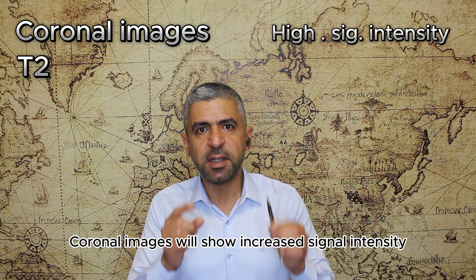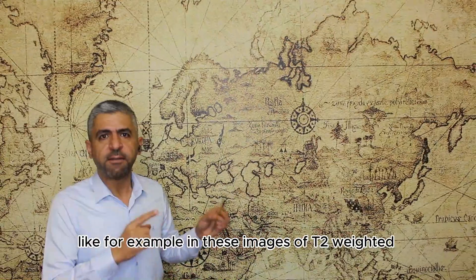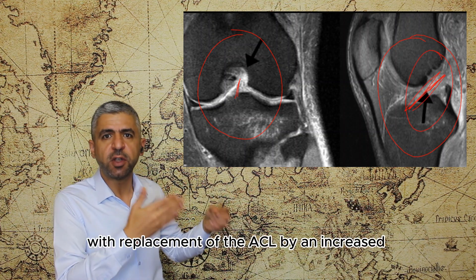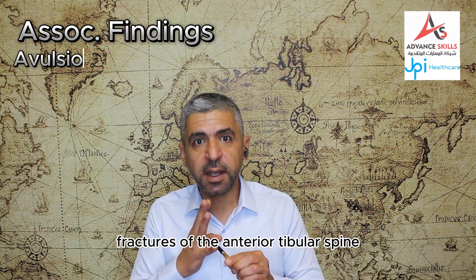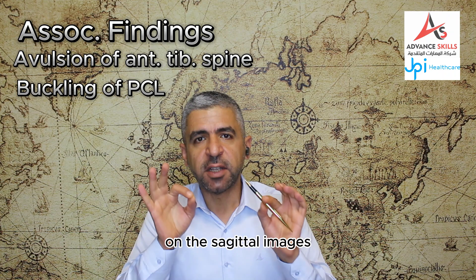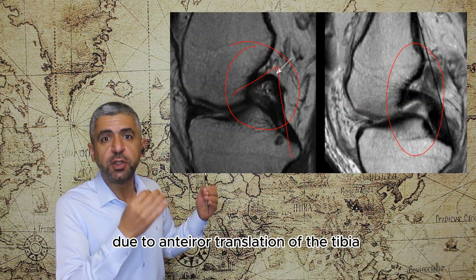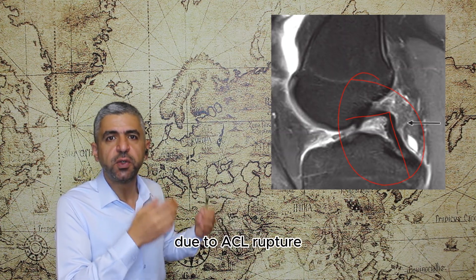On coronal images, increased signal intensity replaces the normal hypointense ligament, with hemorrhagic effusion commonly seen. On these T2 fat saturated coronal and sagittal images, the sagittal image shows ACL rupture with replacement by increased signal intensity, also visible on the coronal image. Other associated findings include avulsion fractures of the anterior tibial spine especially in children, and buckling of the posterior cruciate ligament on sagittal images due to anterior tibial translation. A comparison image shows normal versus buckled PCL, and another T2 fat saturated example demonstrates PCL buckling due to ACL rupture.